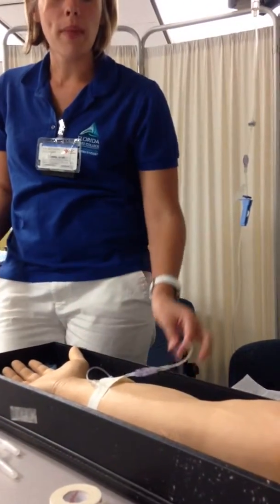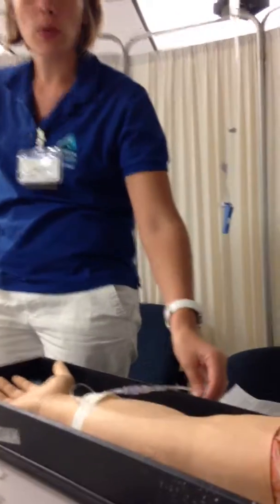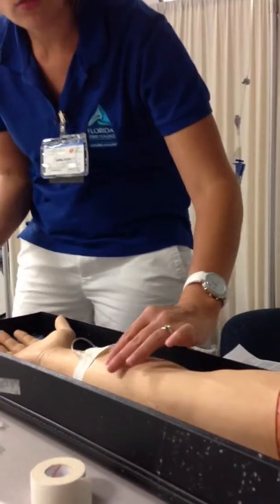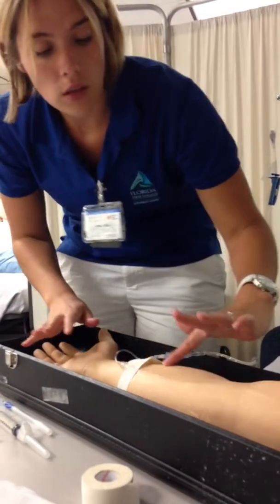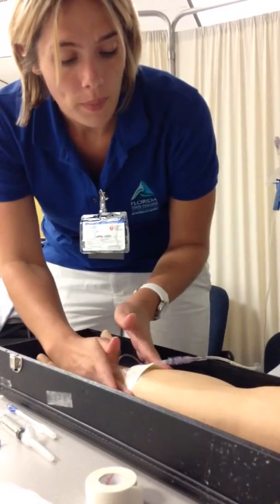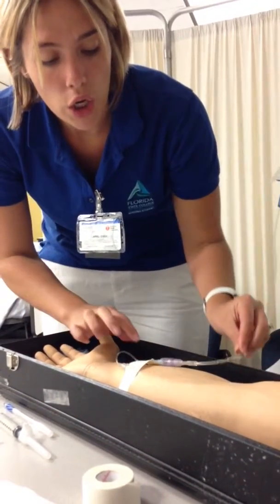I'm going to note the condition of the IV site. It's good to go. I'm going to come back in 15 minutes and reassess. My IV is going to be 100 milliliters. There's no infiltration. When I flushed and pulled back, it aspirated good, so I know that is okay. And my tape is in place. The IV is secure.